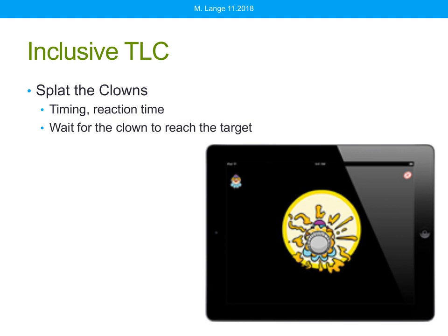So here is one of their apps. It's called Splat the Clowns. Slapstick, throw the old pie in the face has been around, gosh, forever and ever, and it's still apparently very popular with little children, with some adults as well. So we can use this in more of a cause and effect mode where you hit the switch, pie goes flying. That's lots of fun. And we can work on some timing and reaction time.